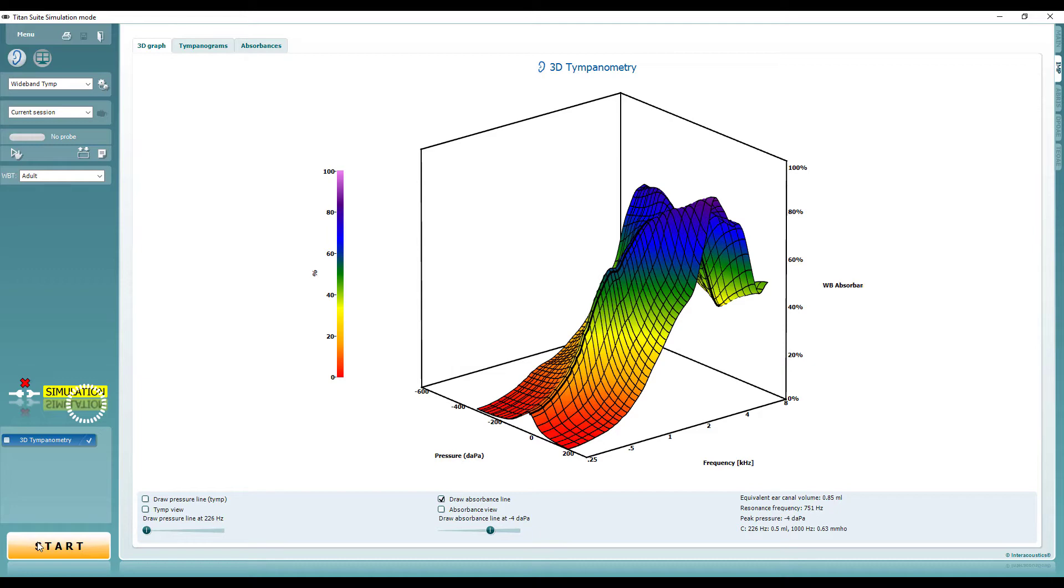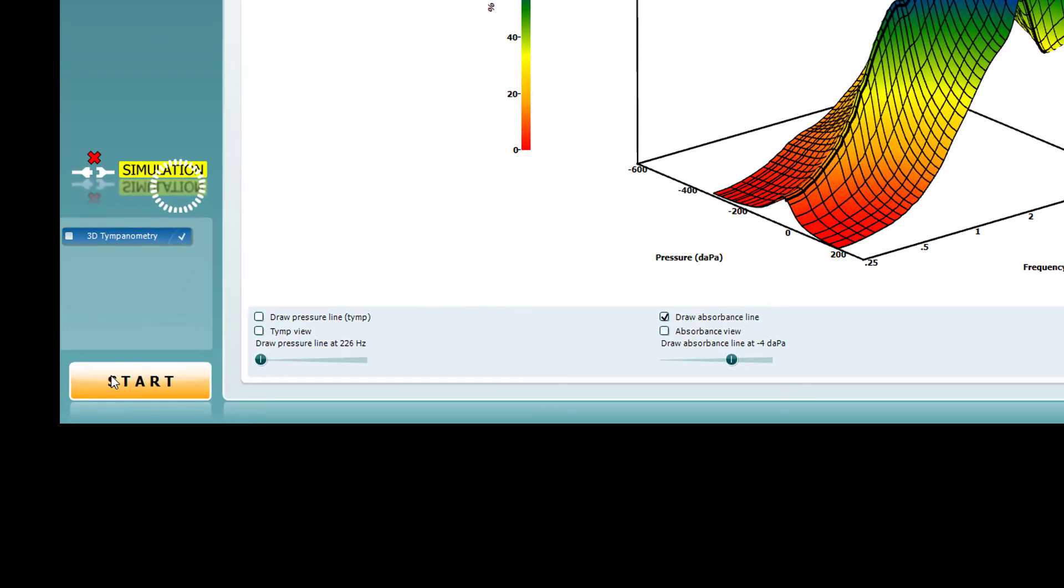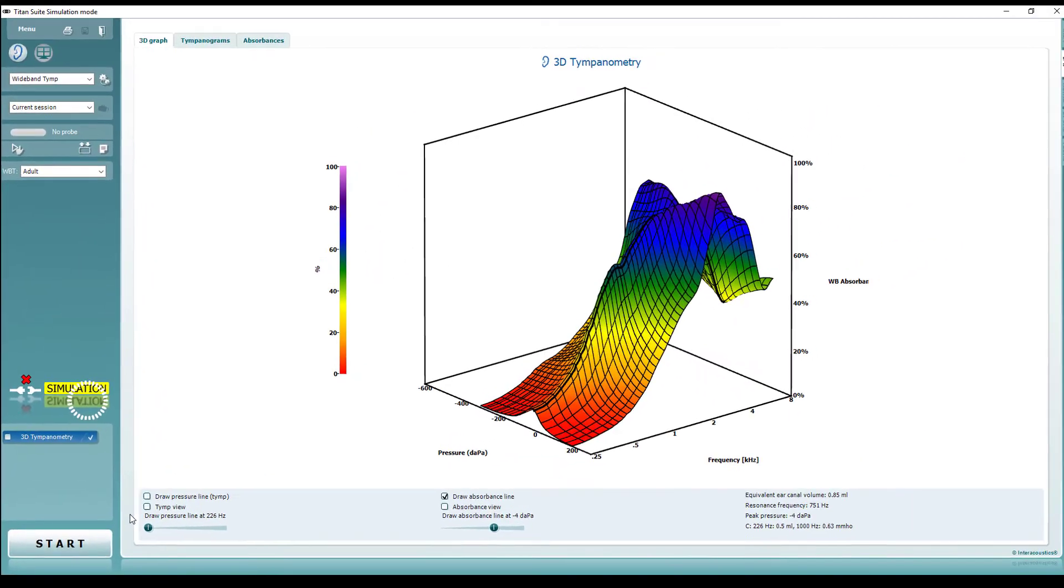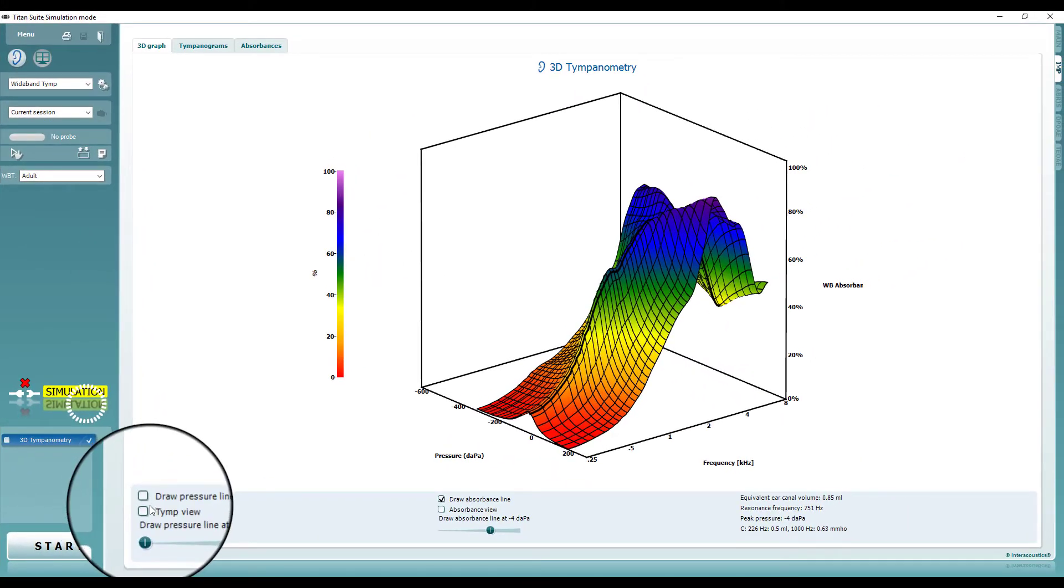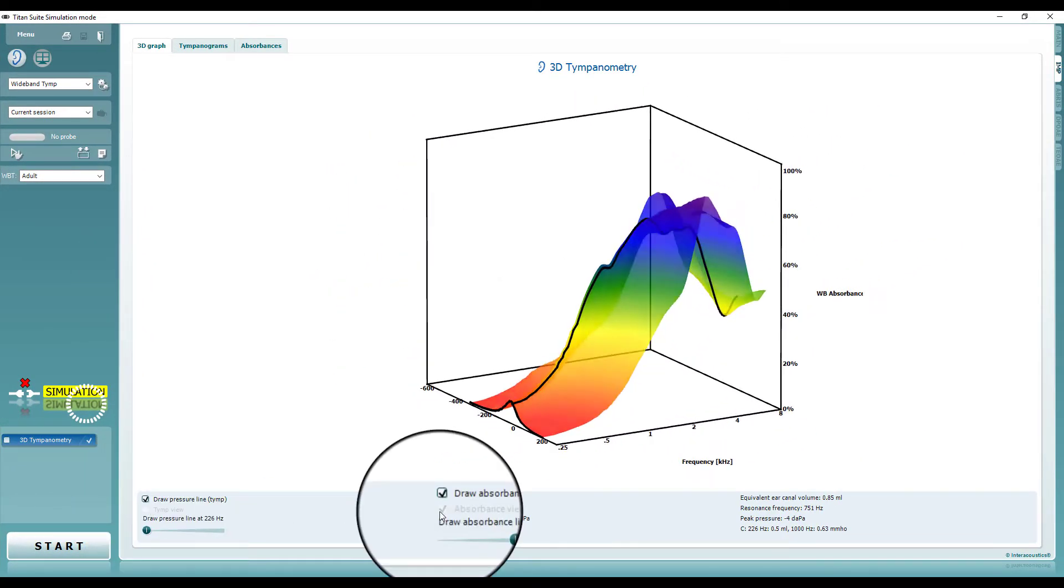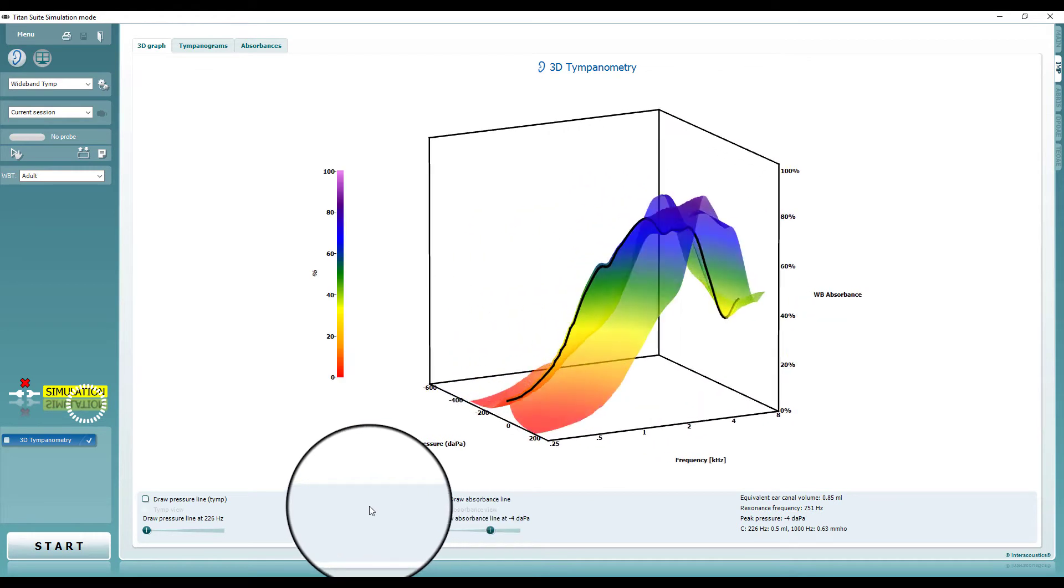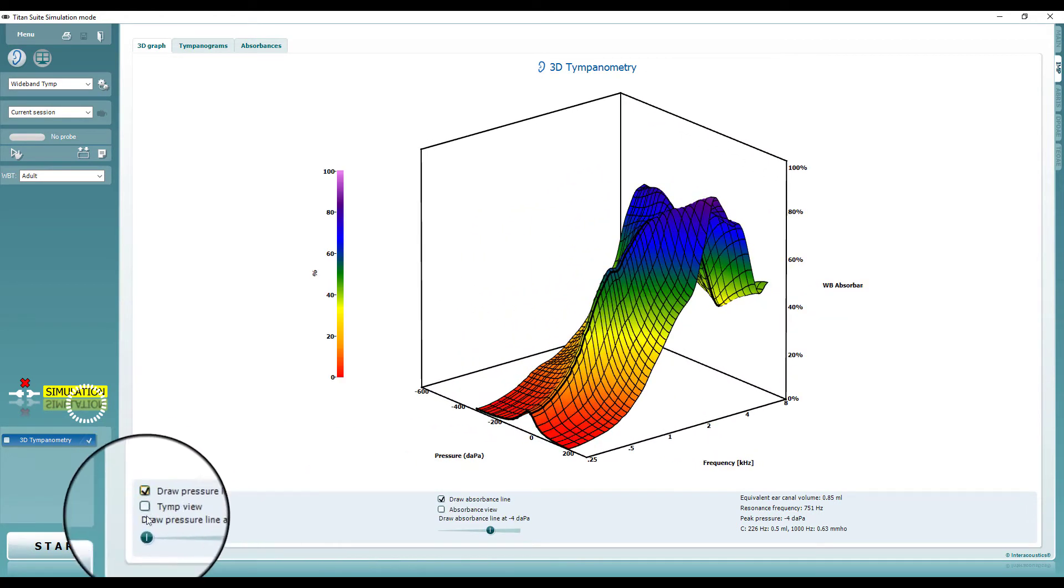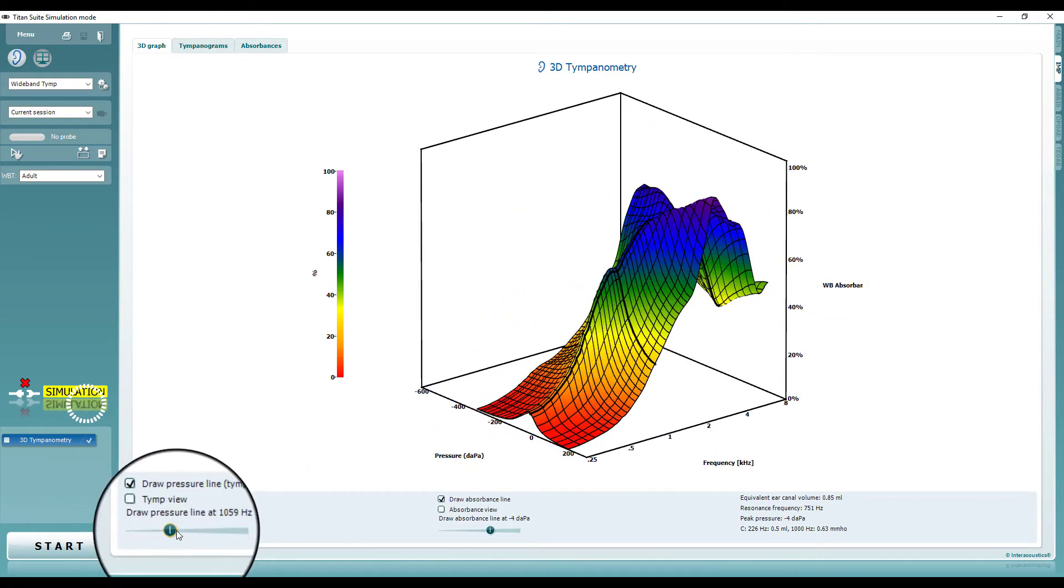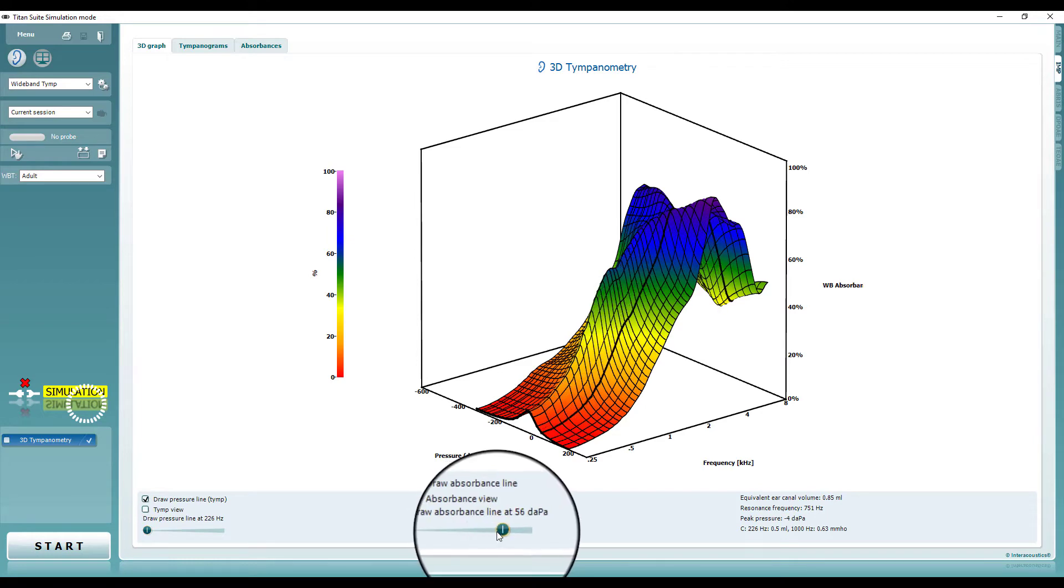Under the 3D tympanogram tab, you will also find a range of data displayed at the bottom of the screen. Here, the view can be changed to display the 2D tympanogram or absorbance graph and the sliders allow these graphs to be viewed at the different frequencies and pressure values.